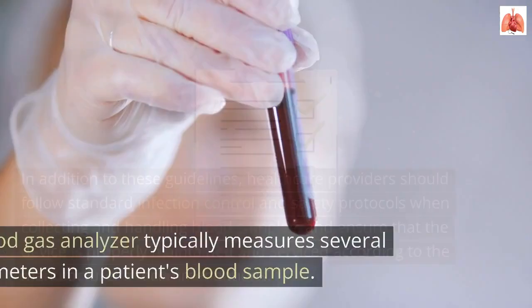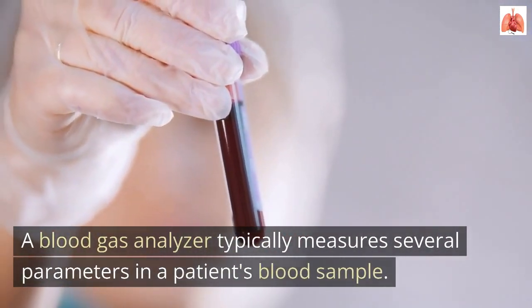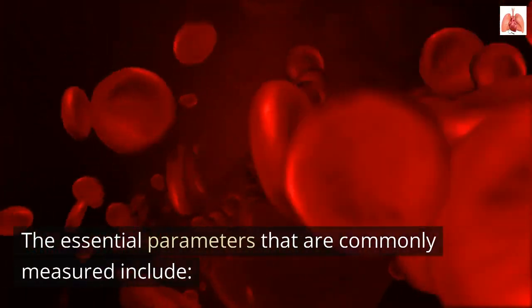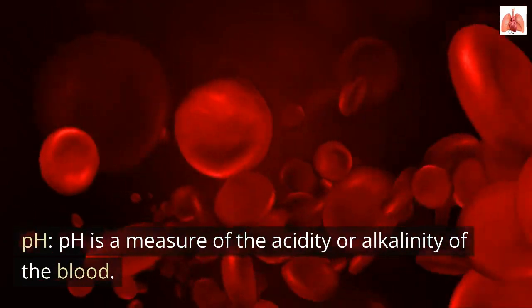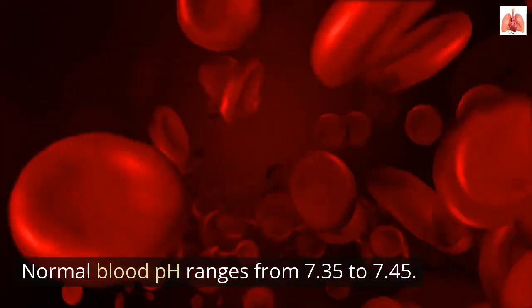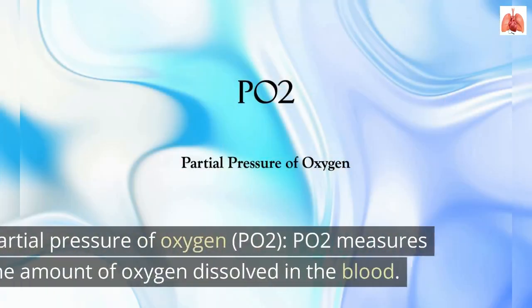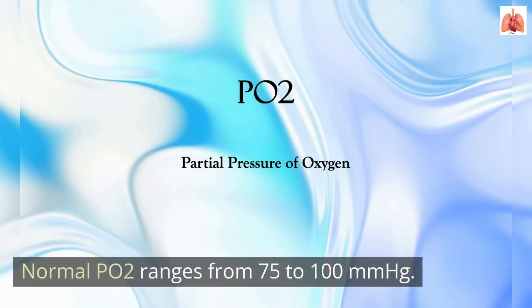A blood gas analyzer typically measures several parameters in a patient's blood sample. The essential parameters that are commonly measured include pH. pH is a measure of the acidity or alkalinity of the blood. Normal blood pH ranges from 7.35 to 7.45. Partial pressure of oxygen, PO2. PO2 measures the amount of oxygen dissolved in the blood. Normal PO2 ranges from 75 to 100 mm of mercury.